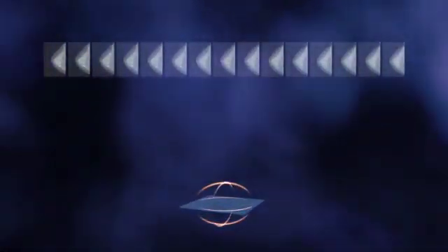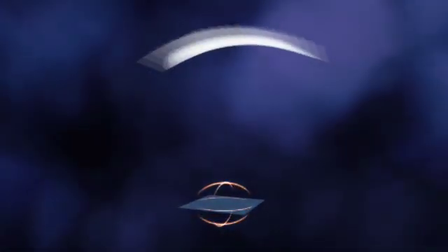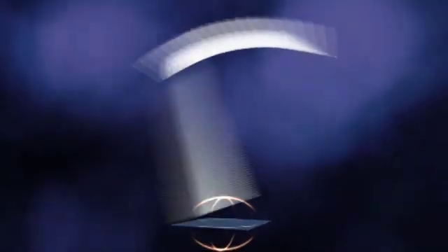Using this initial data set, a sophisticated computer program now back-projects the visual detail into three-dimensional space, building a synthetic tomogram in one-millimeter slices.